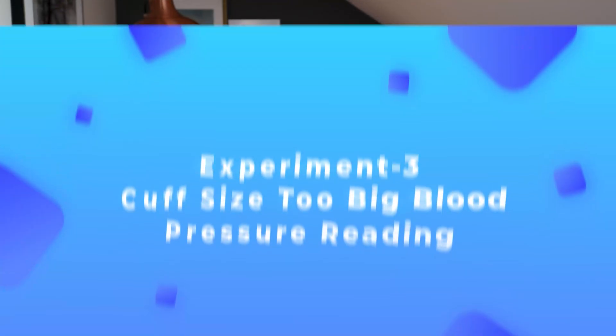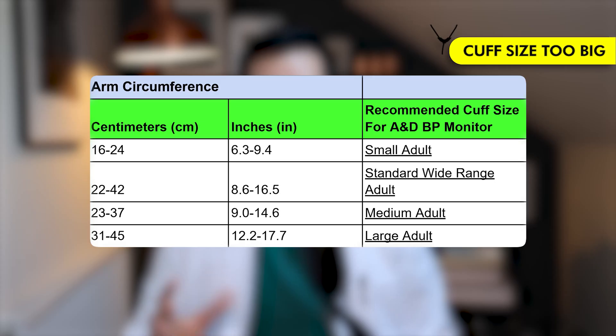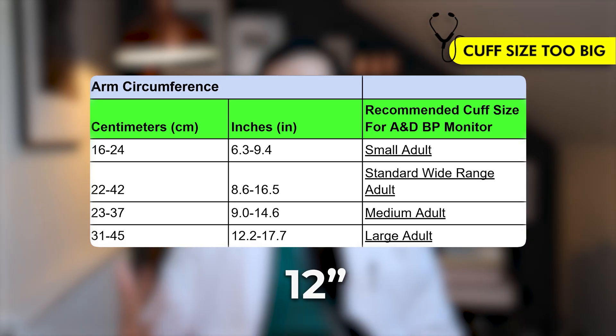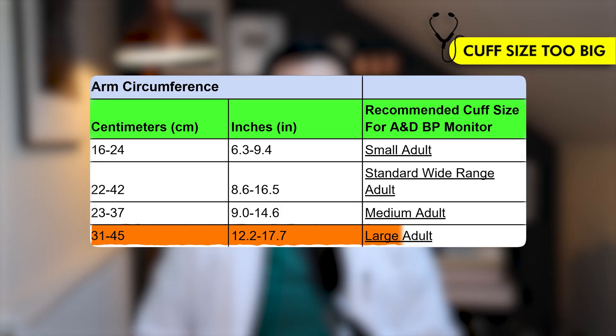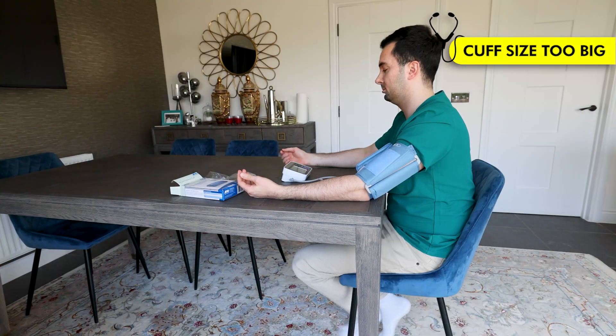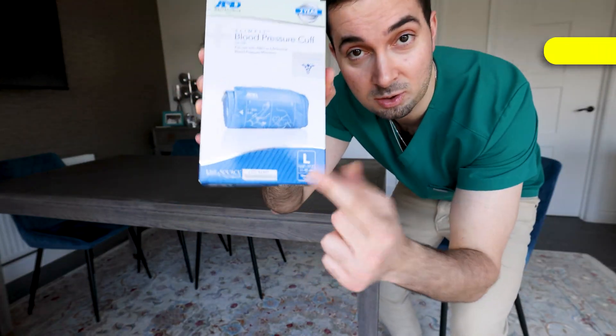Straight onto experiment number three: now we're going to use a cuff that's too big for me. Remember the table — my arm circumference is 12 inches, so the large adult cuff is too big for me. In this experiment, everything is being done correctly; the only difference is the cuff is too large. Let's see what results we get.